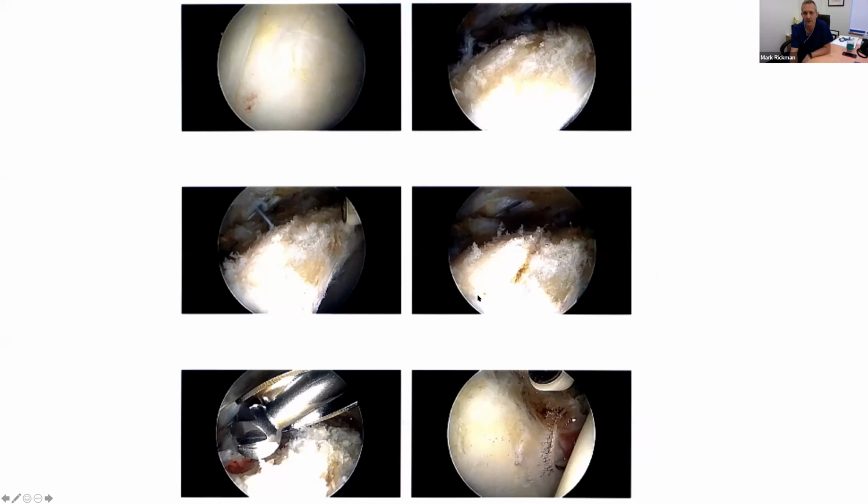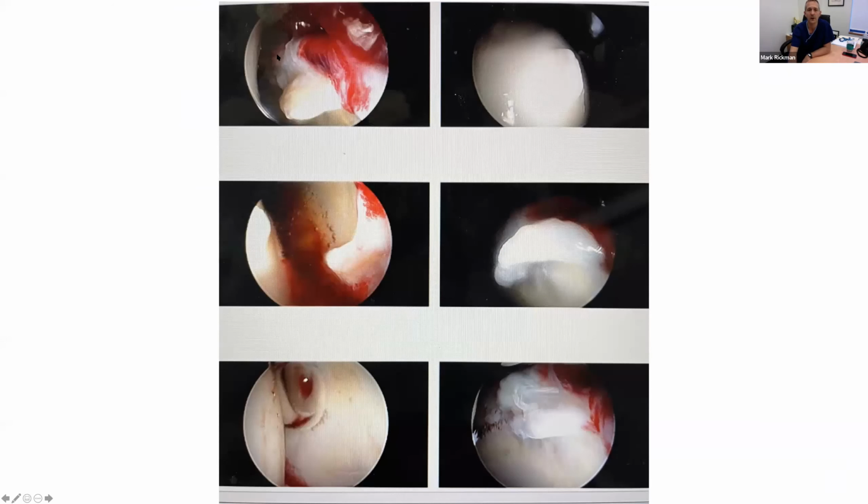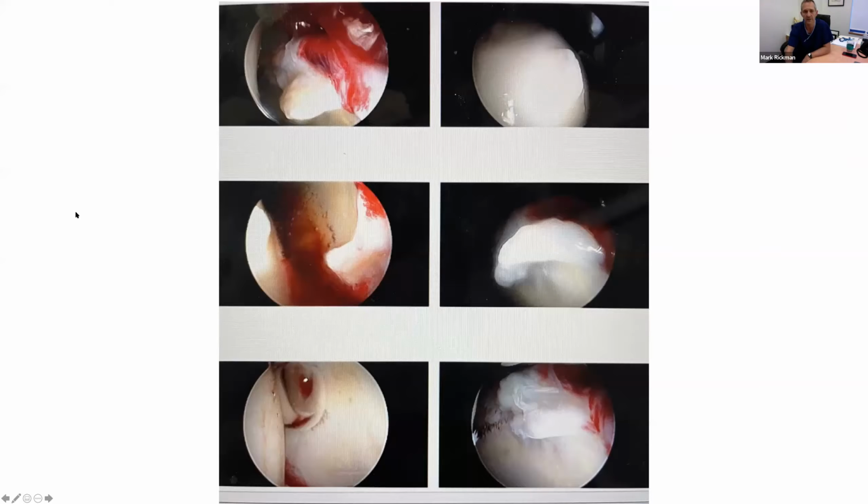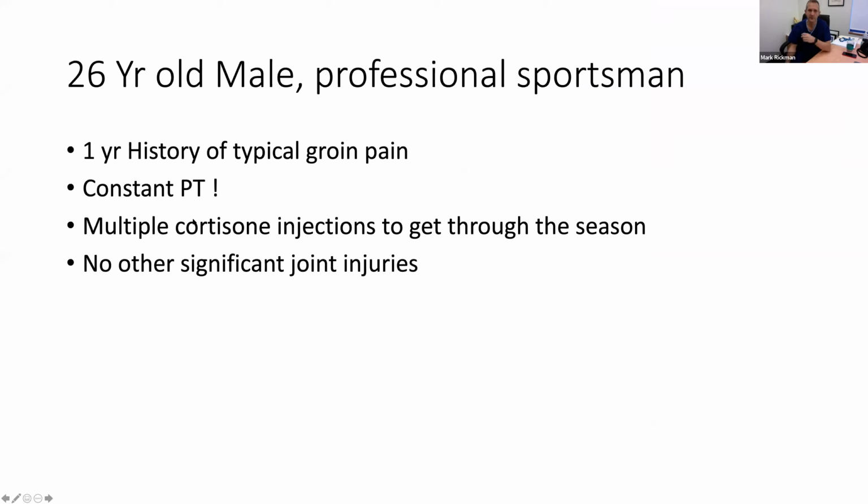And then that's her other side, where again, you can see she's really inflamed. And this is slightly earlier, I think, on the other side, but she's still got this chondral damage. This is articular surface that's being ripped off, that's sitting underneath the labrum. And so on this side, by the time you take away all the bone, there's really not much labrum left. That's the articular surface there, just sort of falling away as opposed to sitting underneath. It was really just to show a couple of different types of impingement.